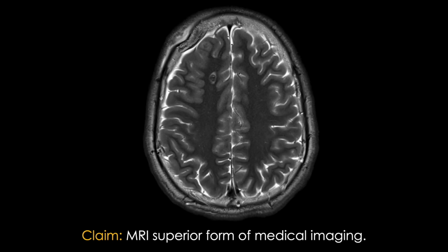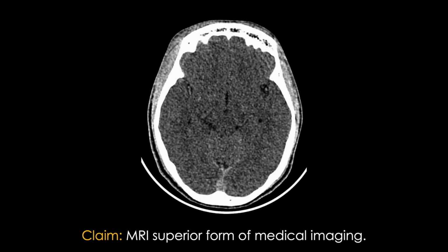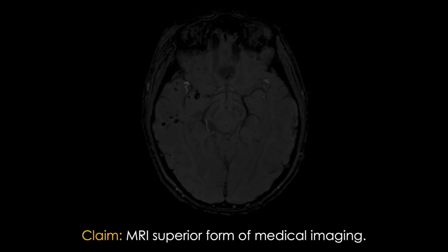Can we see these fractures on an MRI? No. You can make out there's a deformity there, but MRI isn't great for characterizing subtle fractures. Better seen on CT. But let's say a different trauma patient comes in and everything looks normal on the CT, shown here. But the patient is acting more and more altered. We think he may have a more serious shearing neuronal injury. So we order an MRI, and lo and behold, we see all these tiny microhemorrhages that were beyond the resolution of CT, but we can bring out on MRI, suggestive of a diffuse axonal injury.